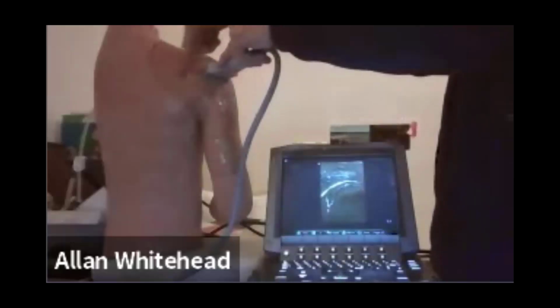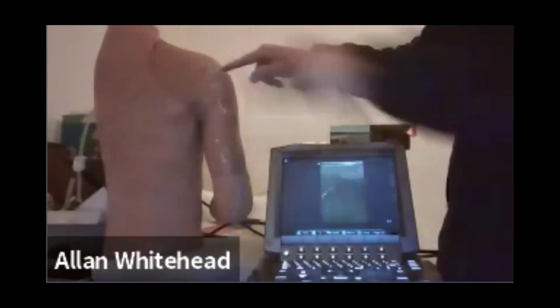Mark with 2 horizontal lines, 1 on each side of the probe, and 2 vertical lines, 1 on each side of the probe. So I'd be there, and I would inject the dislocated shoulder, going in slowly to 3.5 to 4 centimeters depth, aspirating. If I get blood, great, but if I don't, let that not put me off too much.